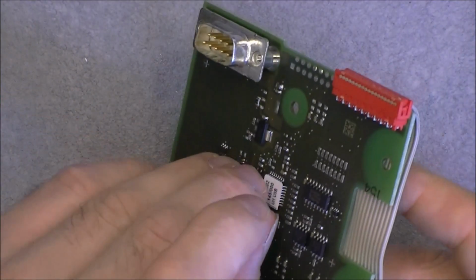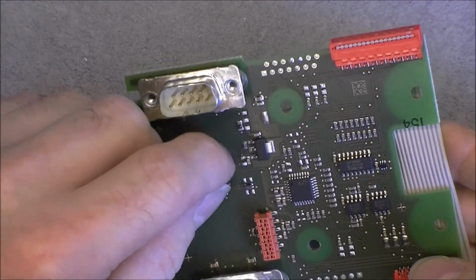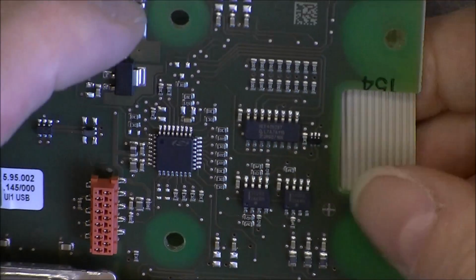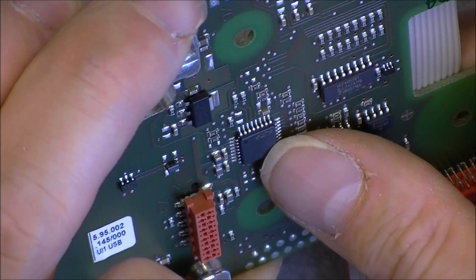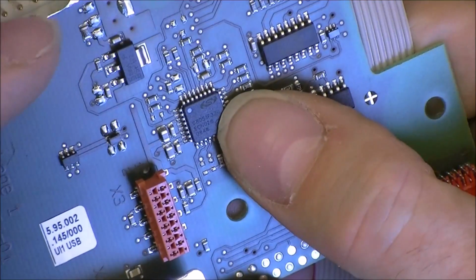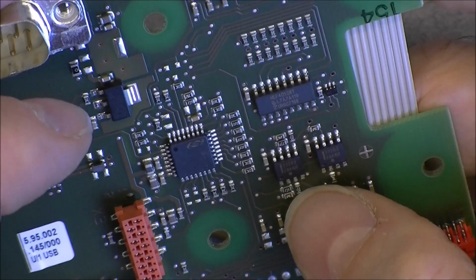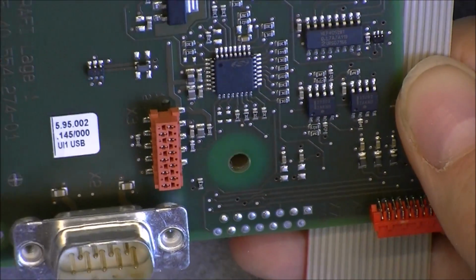So what do we have as the other chips? In fact, I will remove the sticker on this one. And the numbers are almost impossible to read. How far can I zoom? No, not much more than this. So I guess I will make high resolution photos. On here it is written C8051F320. The logo is an S between two half circles. We have HEF4052BT here. And here it is written 33202. Okay, so it will be interesting to play with this thing.